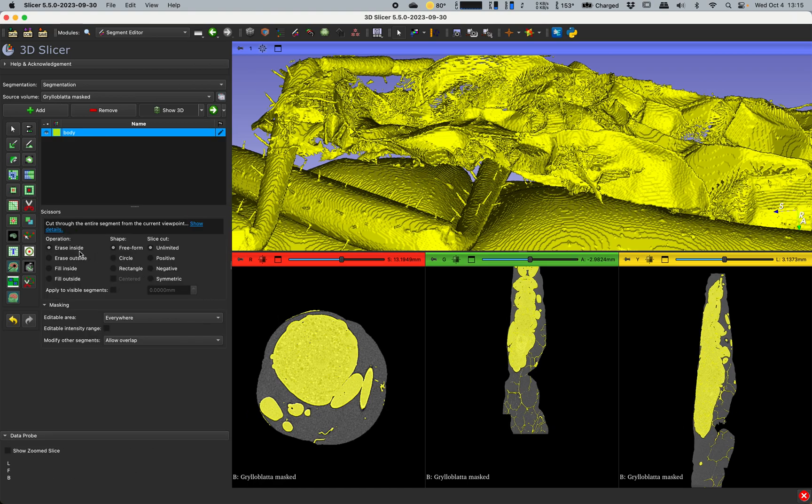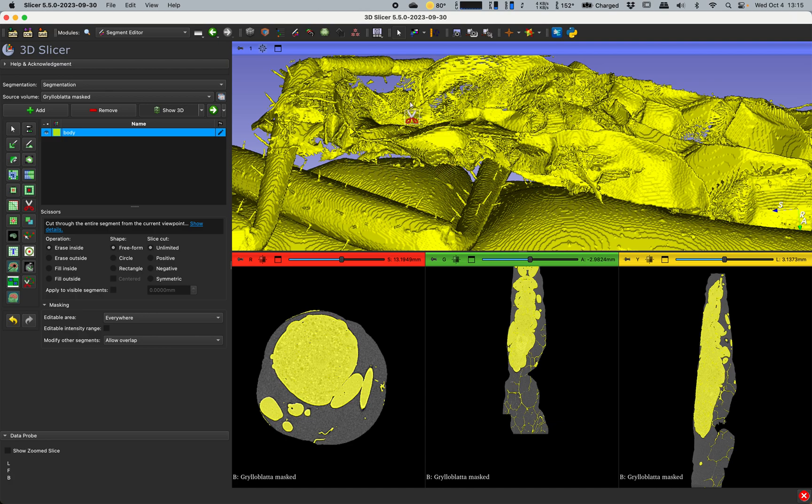I will say erase inside, I'll do it free form, and slice cut is unlimited, which means that when I draw something here in the 3D view it will erase everything all the way through as far as I can see.